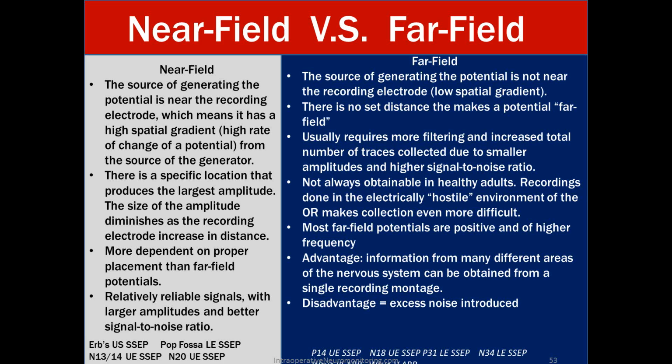So usually when we have people in the OR that are new to the field and they are getting poor SSEPs from a recording standpoint, it is usually because they're too far forward with their recording electrodes, and you just go up to the field and you push them back a little bit in the head over the correct CPZ or PZ area, and you all of a sudden have a larger response because those are cortical near field responses and you need to be as near field as possible.